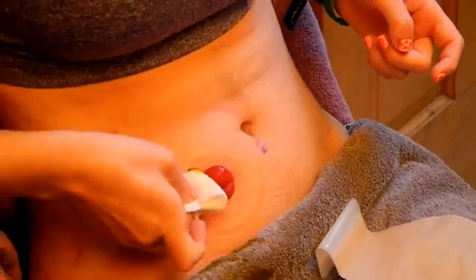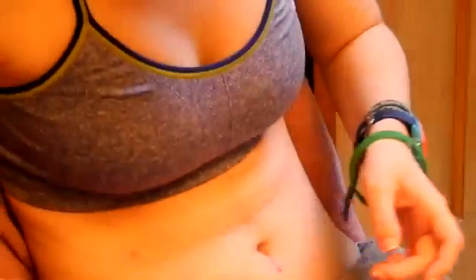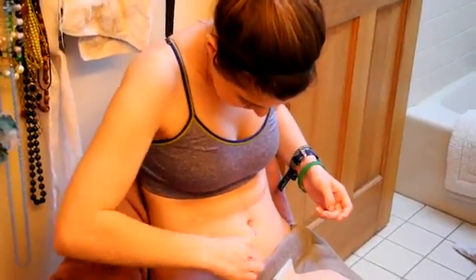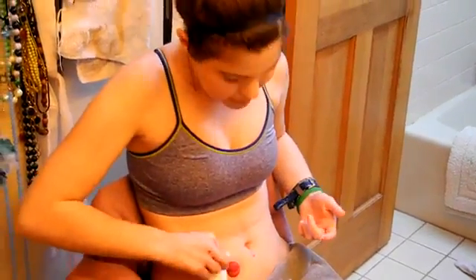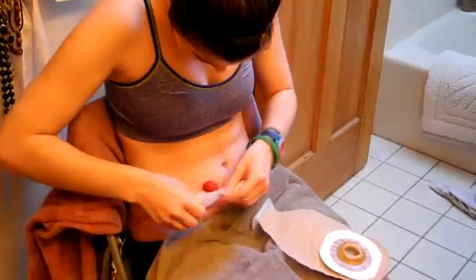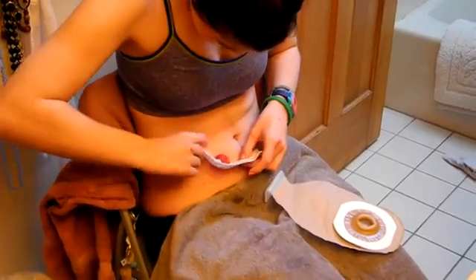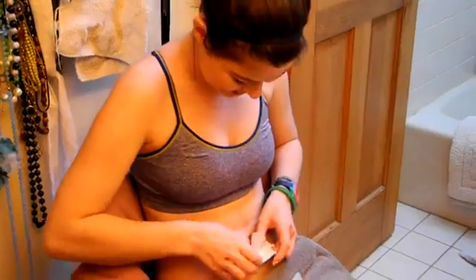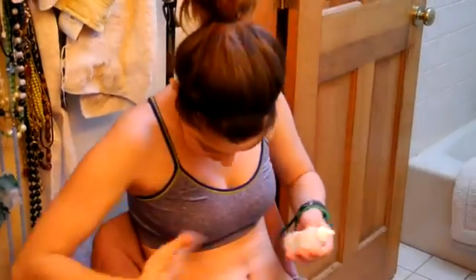So, there we go. And the big thing about changing this, usually, sometimes my stoma is very quiet, but if it's not, the key thing is to have patience because it can get frustrating when your stoma keeps being active, so that's what the marshmallows and the Imodium usually help with. So I like to just kind of fan it off a little bit. Let's try the volcano again. Sometimes this works great, just not today. So next I'm going to use my stoma powder.